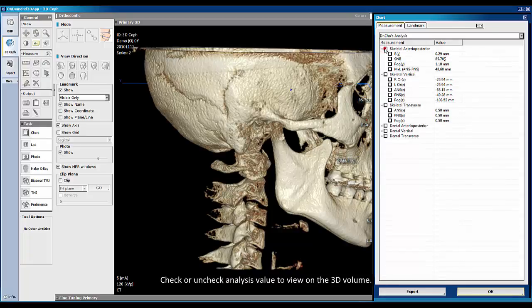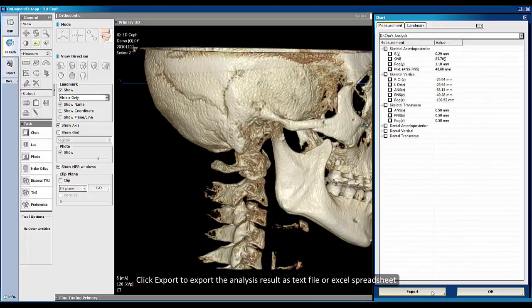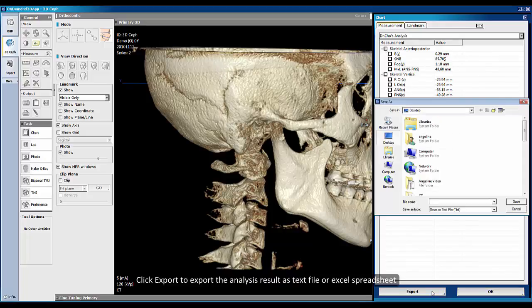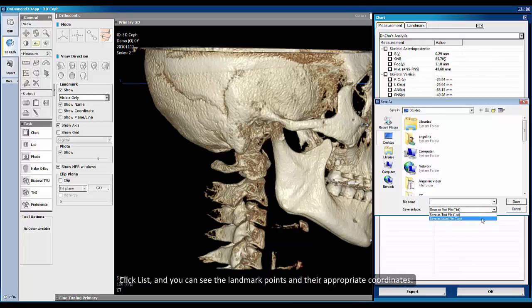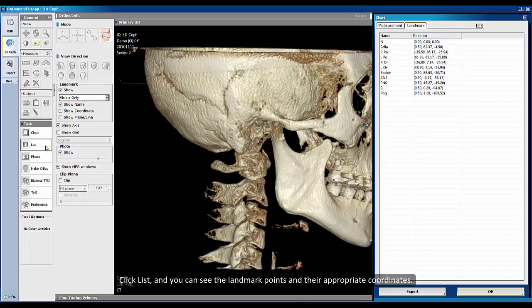Check or uncheck analysis values to view them on the 3D volume. You can also click Export to export the analysis result as a text file or Excel spreadsheet. Click List, and you can see the landmark points and their appropriate coordinates.